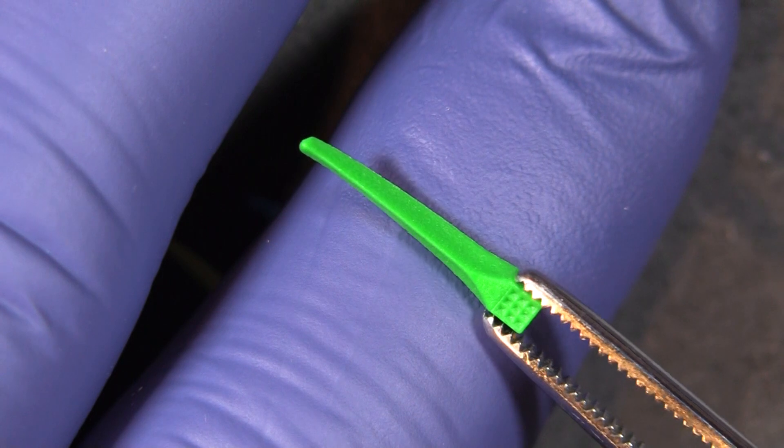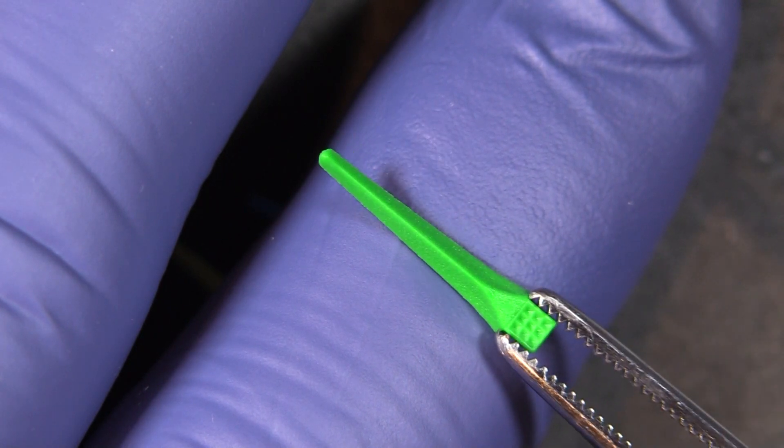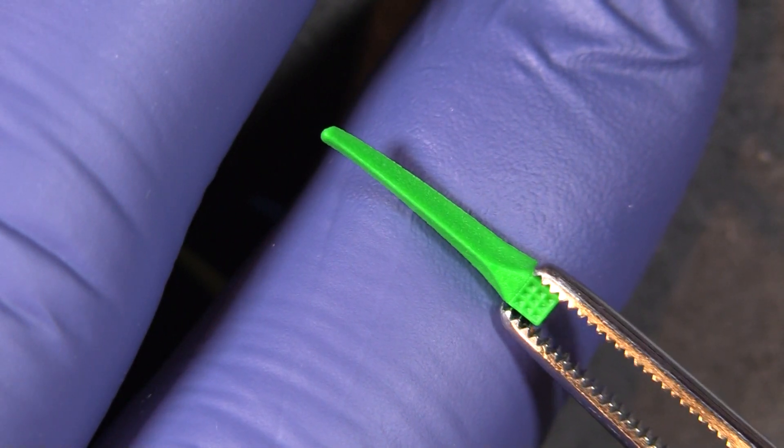On the sides, those textured sides, you can see that it's not a flat surface. That is cupped out to help shape the matrix band to the tooth in a more natural curvature, rather than having a flat portion pushing up against the matrix band.